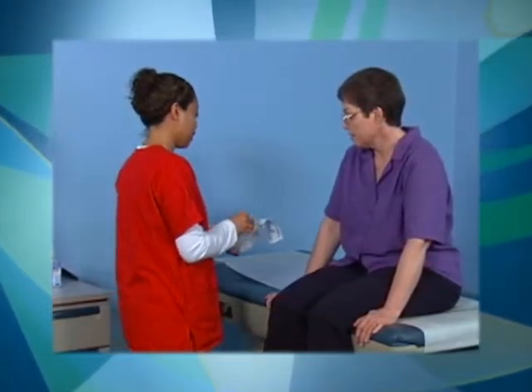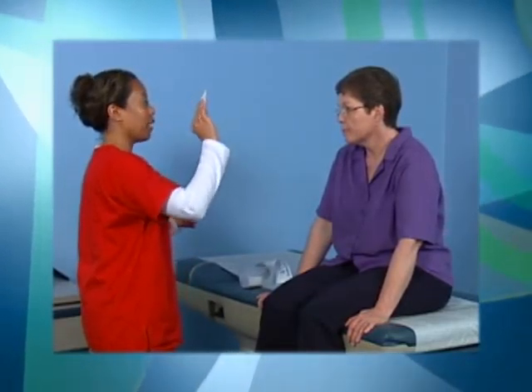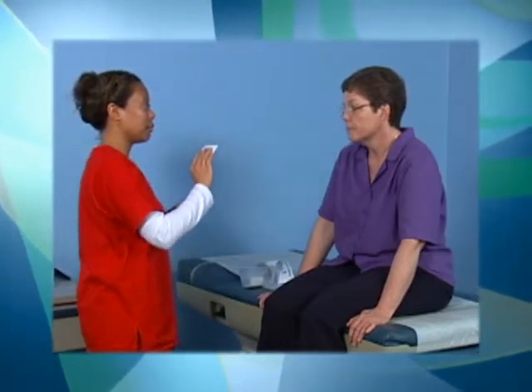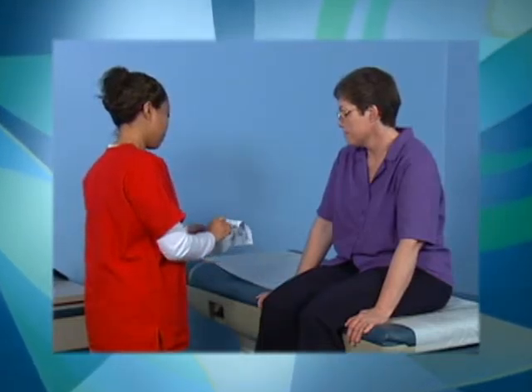The medical assistant will show you how to instruct a patient in the collection of a clean catch midstream specimen. It is important to provide complete instructions for the collection of the specimen. Failure to instruct the patient adequately may mean the patient has to return to the medical office to collect another specimen because of contamination of the specimen with normal flora.